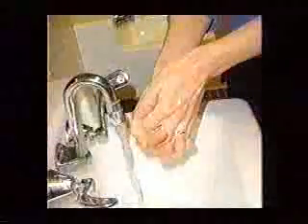Remember to subtract the weight of the sling, then record on the permanent record, including the time, weight, and the scale used. Wash your hands.